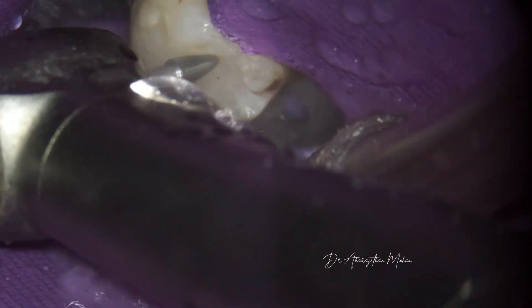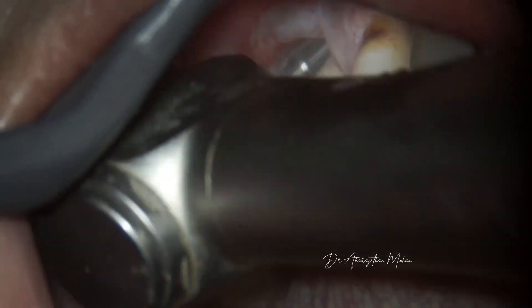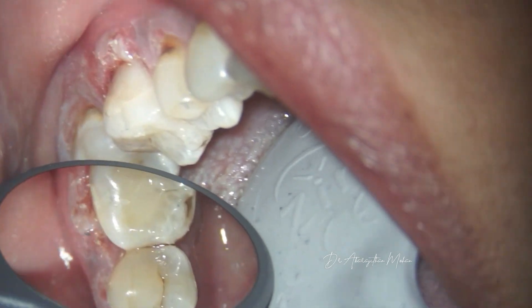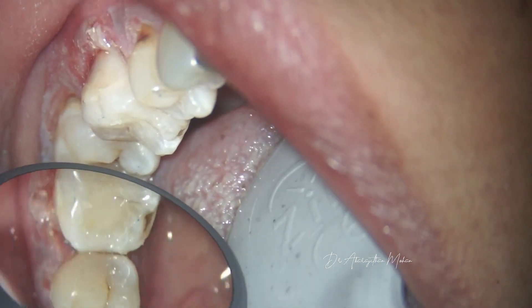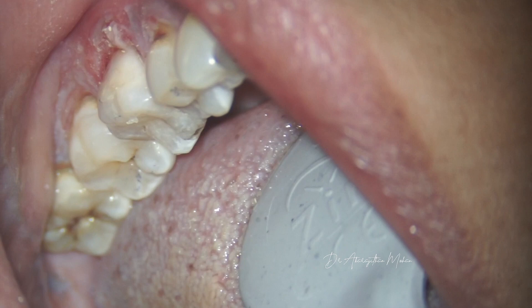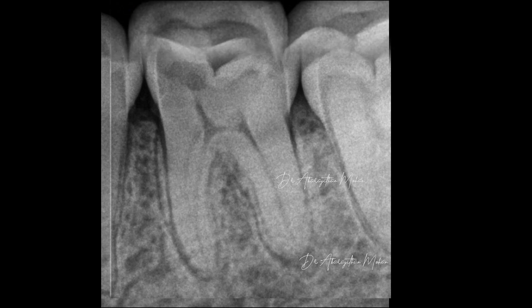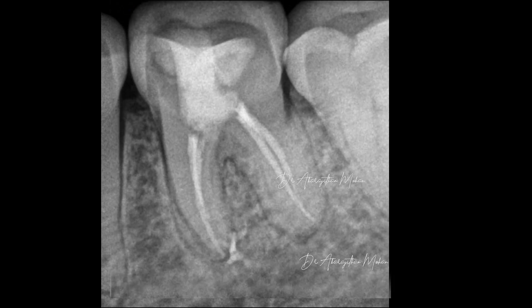After completing the obturation, the access cavity is sealed with warm composite in a bulk-fill technique. This is after finishing and polishing of both the proximal and the coronal restorations. This was the pre-op, and this is the executed root canal treatment — conservatively treated with the pericervical dentin preserved, and the orifices nicely filled with the warm bulk-fill technique.